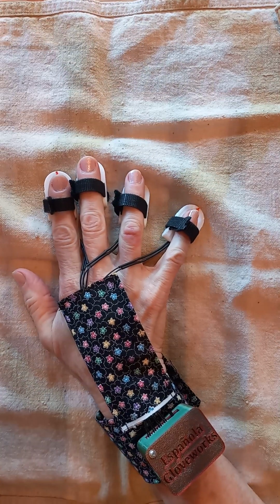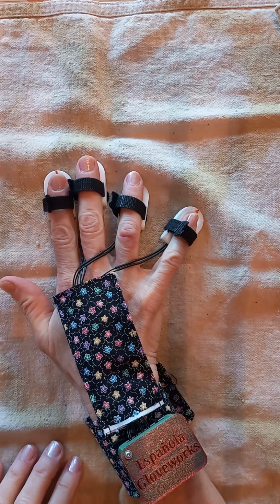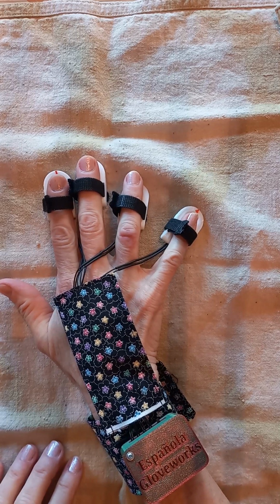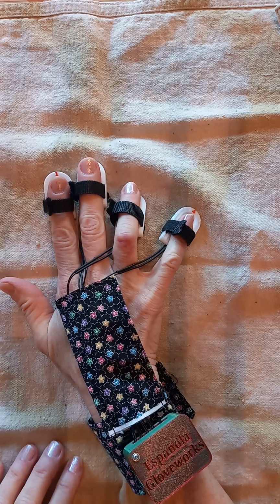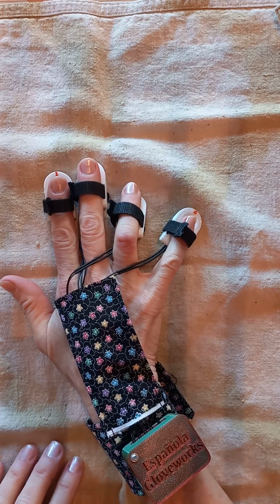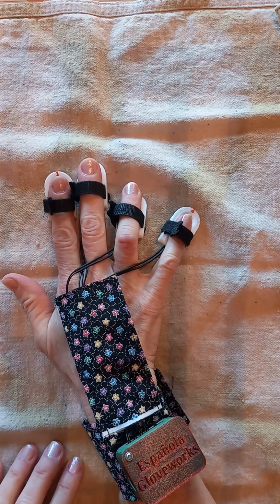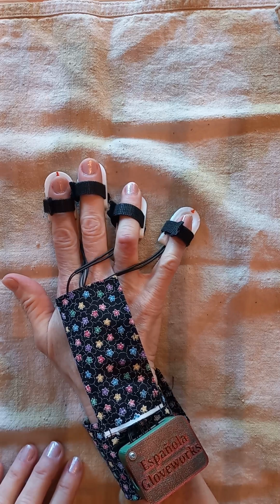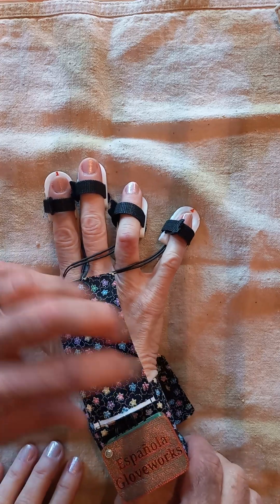So the idea is to send random stimuli into the fingertips as a means to scramble the bad rhythms that get set up in motor cortex by the lack of dopamine. Beautiful. Any more observations on that? No. Good. So 2 hours in the morning, 2 hours in the afternoon, you should be able to be fully mobile and as mobile as you currently are to move about without really even knowing that these are on. After 2 hours, we come and turn the switch off.